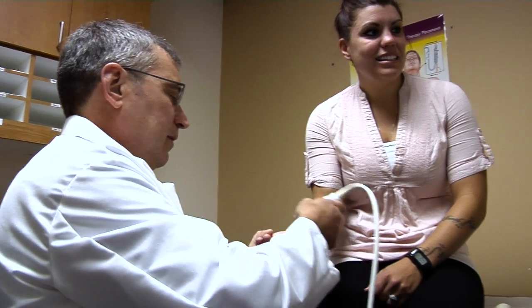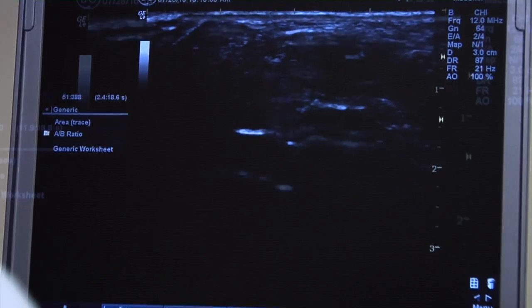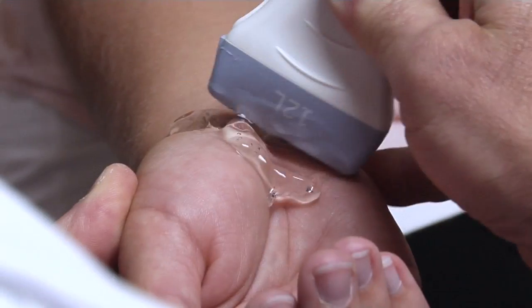The other aspect is that you aren't poking around to get into the area that you want. You can see that the needle is about to approach the precise spot, and then it minimizes the discomfort, so injections of a hip or a shoulder joint can be done with much less discomfort.